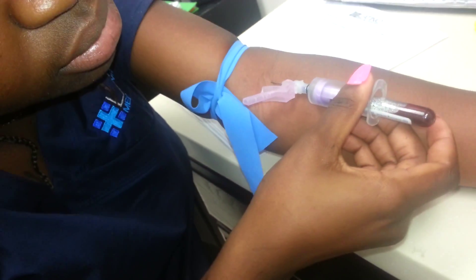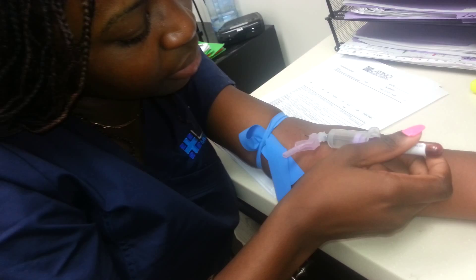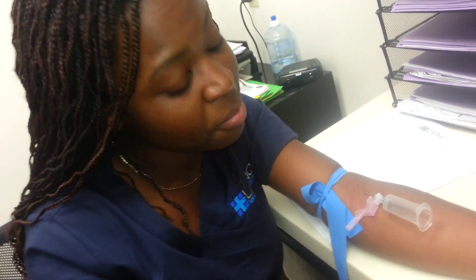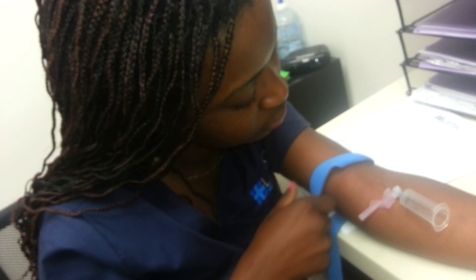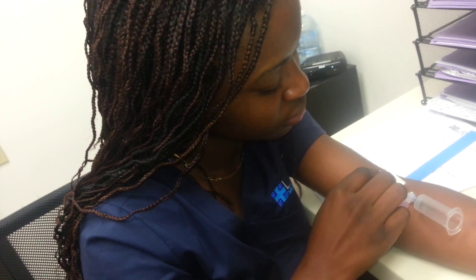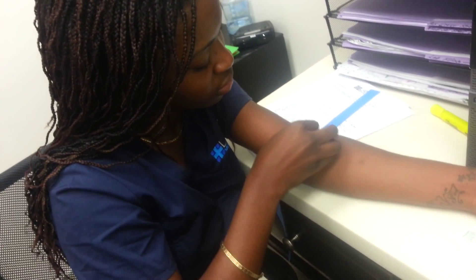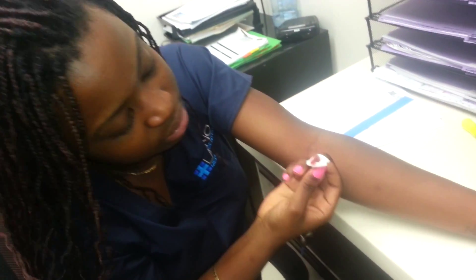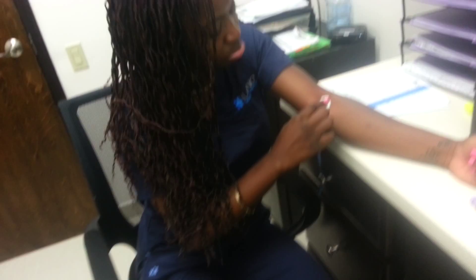See my blood coming? Yes, I see. Now get it off. I know, but I got to remove the tube slowly. There we go. I'm a soldier or what? I'm going to remove the tourniquet. I need the gauze. Bingo! And yes, I'm bleeding. You want to see it? So this is how you properly do it — you take the needle and throw it in a sharps container and apply pressure on the wound. It will stop the blood.